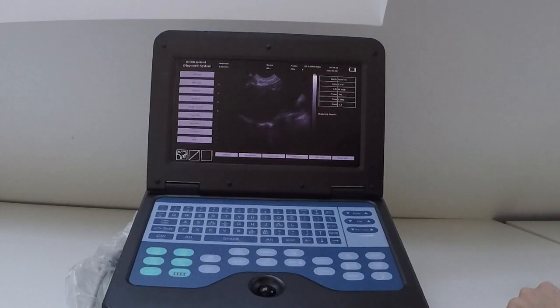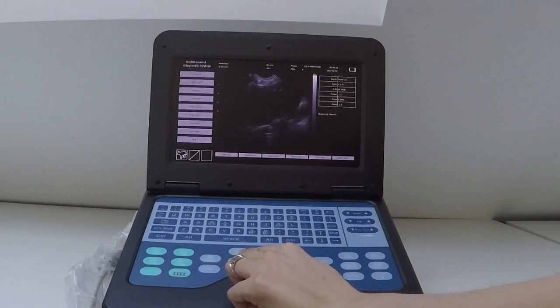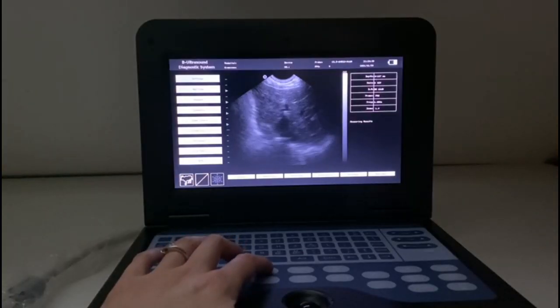You may wish to adjust your scanning frequency. If you're scanning a very large animal and you're lacking penetration, you might want to reduce your frequency. You can change frequency by pressing the FREQ button here — you can only adjust it one way on this machine; it'll just keep cycling through.